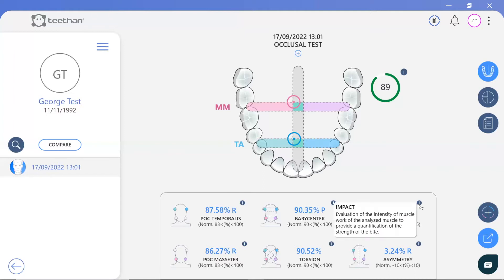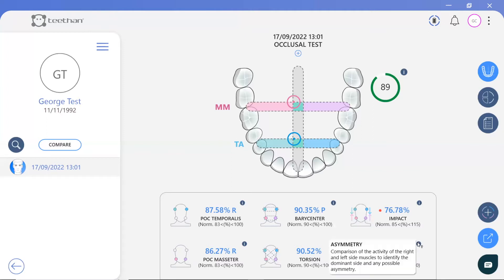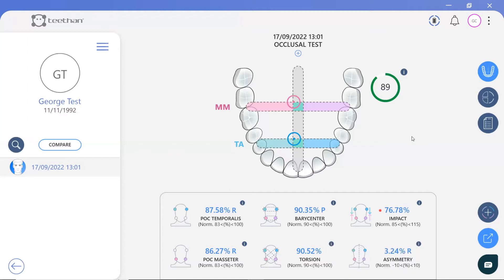Impact monitors the intensity of the muscular work to quantify the strength of the bite. In this case, the patient is below the normative range, thus indicating a weak bite. A particularly high impact score means the patient is a clencher and will likely suffer from bruxism. The asymmetry value compares the activity of the right and left side muscles to identify the dominant side and any possible asymmetry. This patient is within the normative range, but with a slight prevalence of the right side muscles.